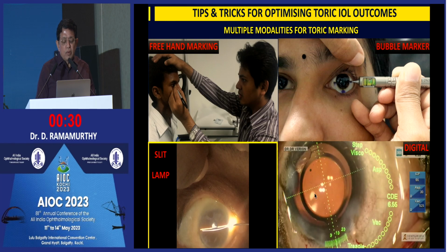Of course, if you are doing a large volume of toric intraocular lenses, which I believe all of us should be doing and addressing, whether you're doing multifocals or not, having access to a digital marking device like the Verion or a Callisto is a great way to go.